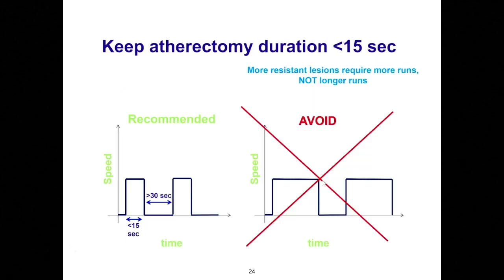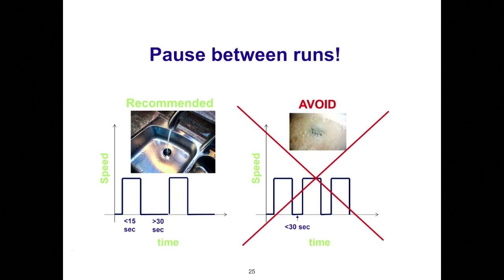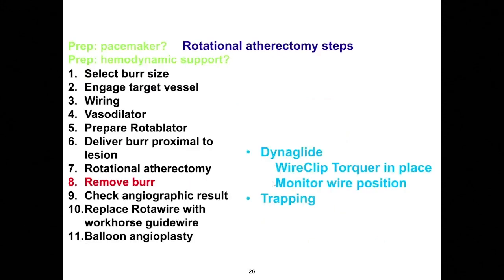Again, as I said, this is important to understand that you give short bursts, 15 seconds, and then give a long duration between the burr time, and not give long duration of burring and short duration of inter-burr times. This is important to realize because this is like a sink. So if you have sand there, and you're putting in water, unless you give time for the sand to wash out, the sand will just accumulate there and it will plug the sink. And this is the same thing that happens if you give a long duration of rotablation and give short periods of rest between the bursts.